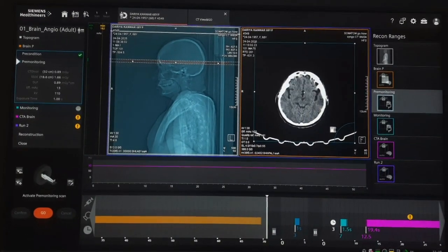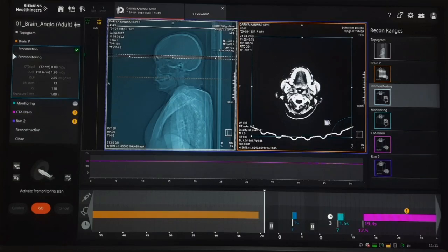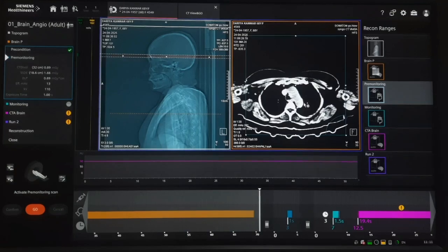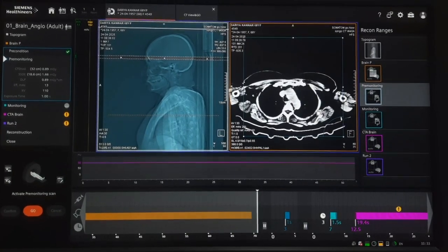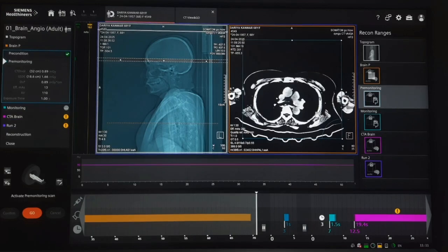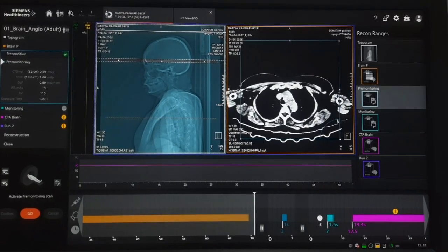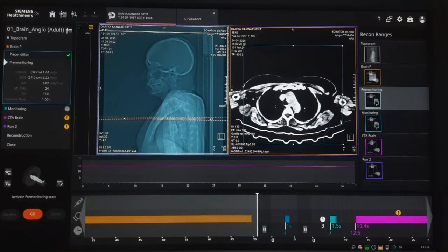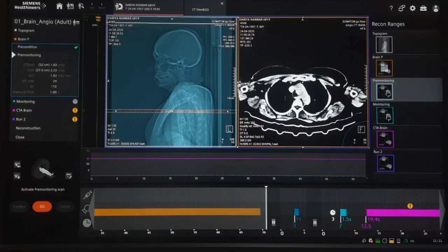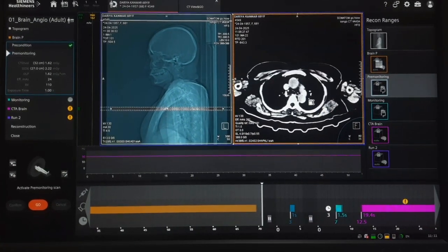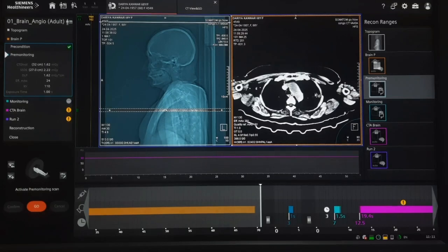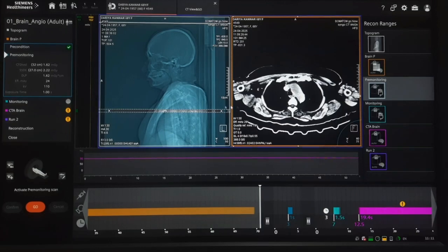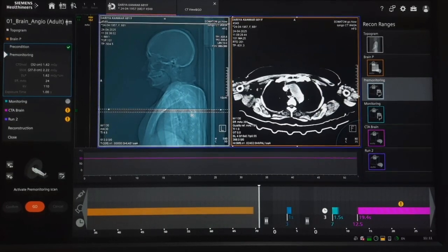Now you need to place the locator on the ascending aorta. Begin pre-monitoring on the topogram, setting your scan location at the ascending aorta and monitoring for optimal timing.